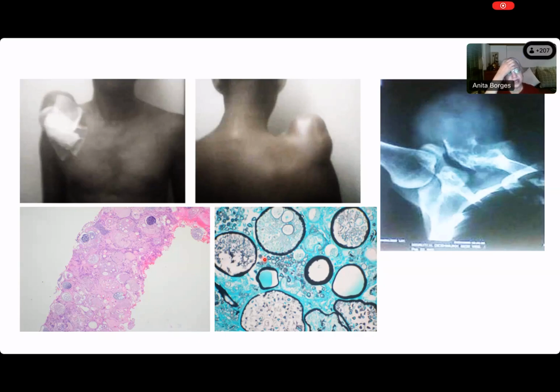Something that has a green counterstain and it's black. GMS. Very good. So what is the black in a GMS? In fact, what is black in any stain that we use? Silver. Excellent. Yes, Sarangi. So silver has been deposited.